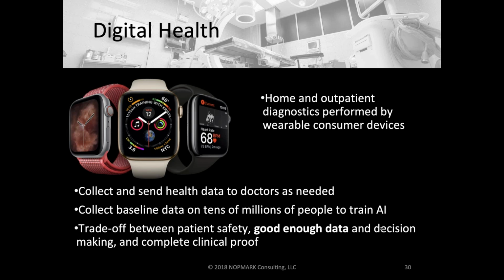And when there's an issue, it notifies you to go see a doctor, or an option that they'll have is it will send the data to the doctor. And within devices like Apple Watch, while it may start off with ECG, if you look at a roadmap, it'll have everything from glucose meters, pulse oximetry, respiration rate, and a whole set of physiological parameters. So this area of digital health becomes the focus, and it changes software testing because software testing will then get realigned with this digital health paradigm.